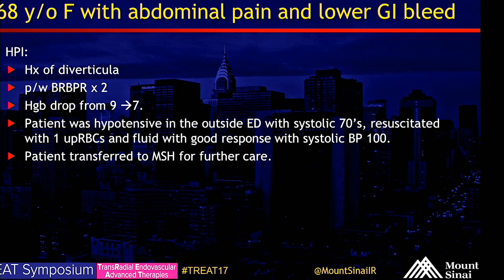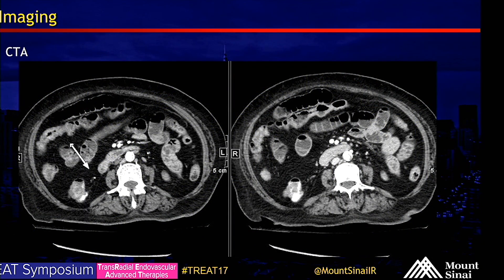What we have done so far is a diagnostic angiogram of her SMA. We had already localized the bleed to the right side of the colon, and we were able to do a cone beam CT. It shows the area of the bleed in the right colon as well as the vessel that is bleeding up to it.